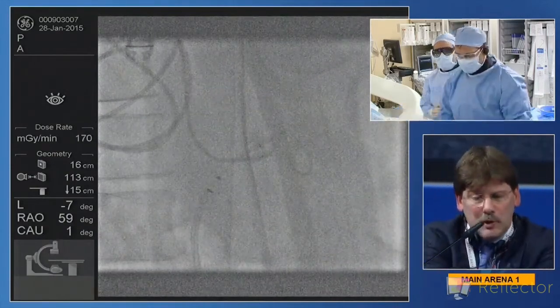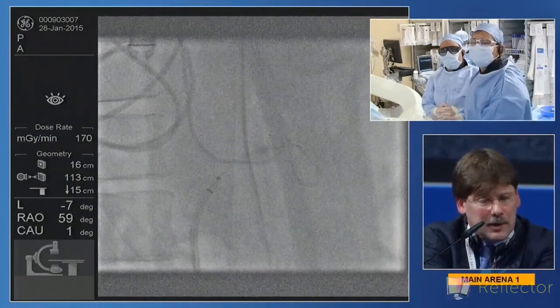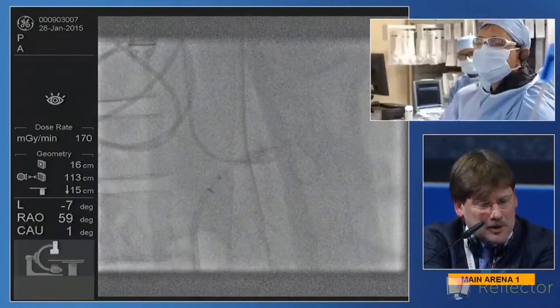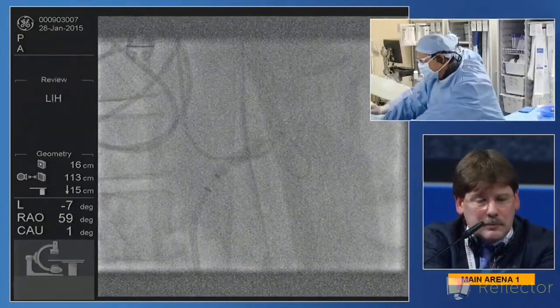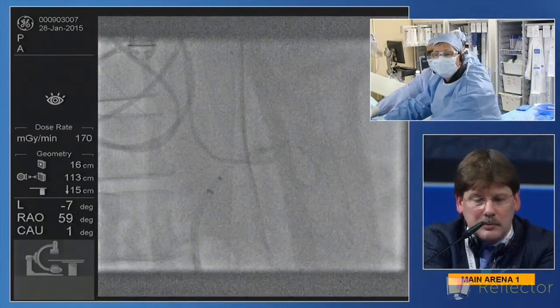So, John, as you're pulling it back and working, we've got about a minute and a half left. I want to thank your team there. You did 2 cases here that were spectacular, 2 in the other room, and we all know how much work that is. So, to your entire team, thank you very much. It's been outstanding. Hold this. Yeah, so we're going to get some good pictures for you here before we do that coiling. I think that this is going to really look nice.